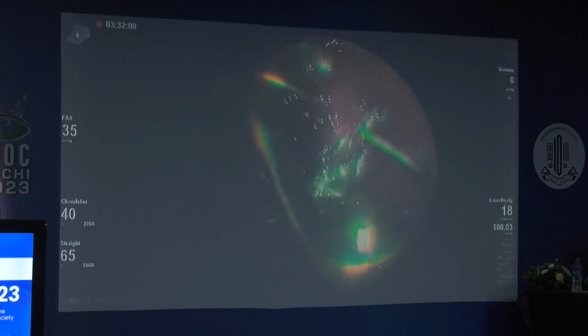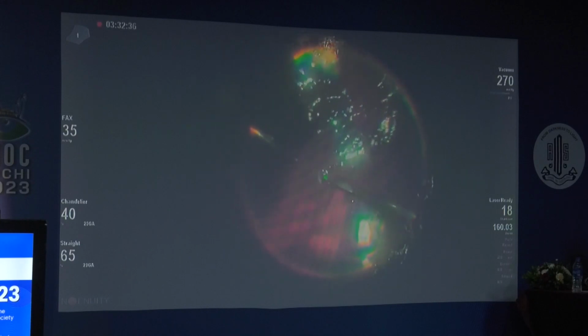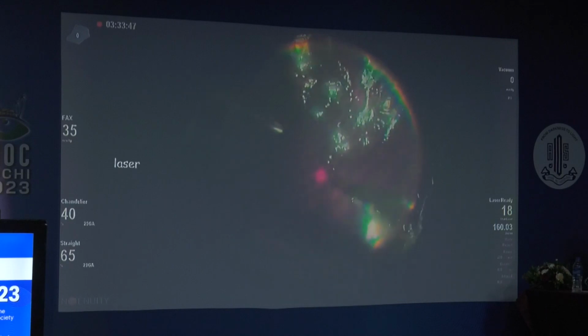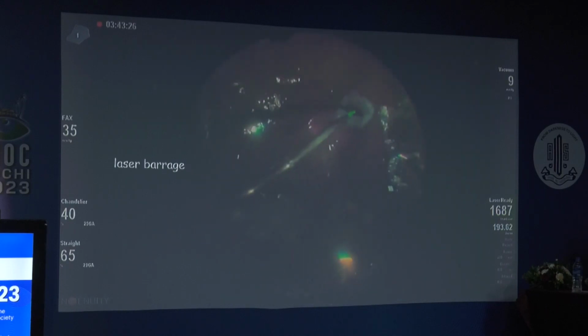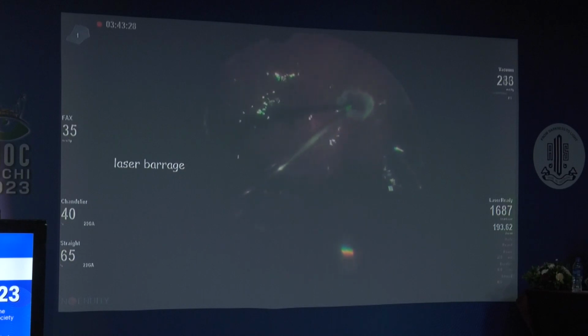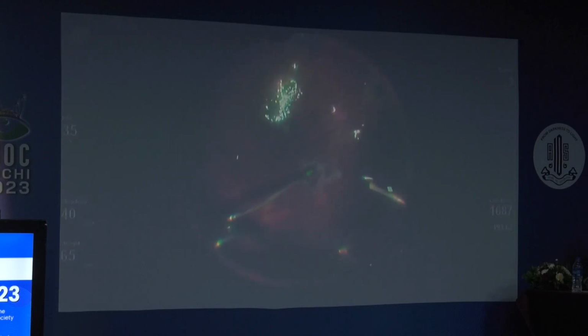Once that was done, a good laser was done, not only around the retinotomy, but also around the primary breaks which were there in the periphery. And after a final fluid air exchange, and once I was satisfied with how the retina was settled, I concluded the case with a silicone oil tamponade.